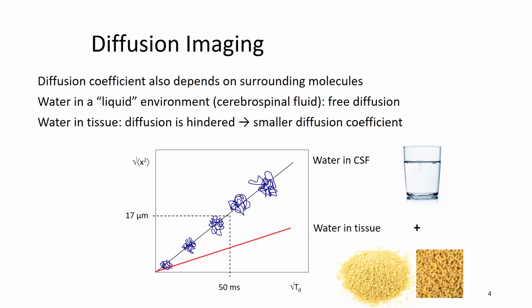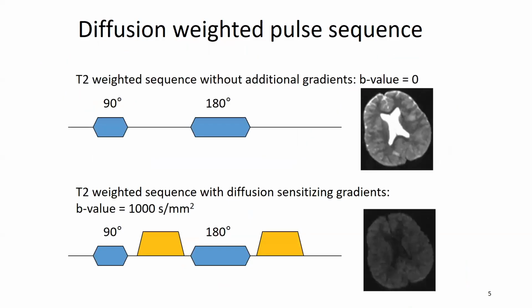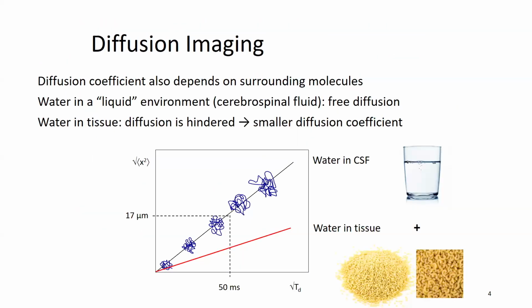Potential speed? No, I don't know that one. You can find it if you look at diffusion coefficient, Brownian motion. You can go further into that. Yeah, that's too far for this lecture. Oh, how can we measure it?